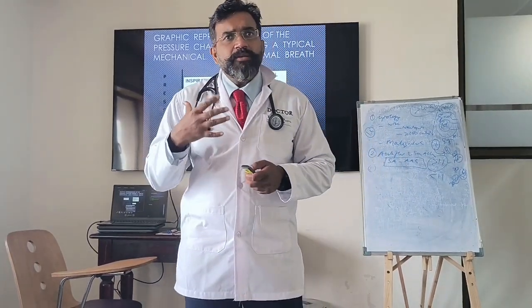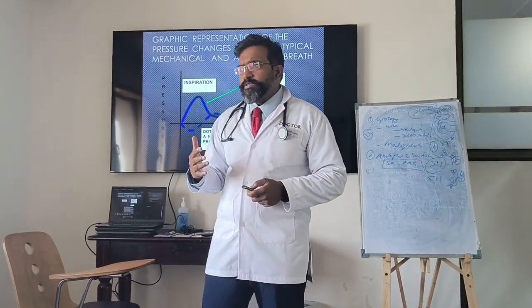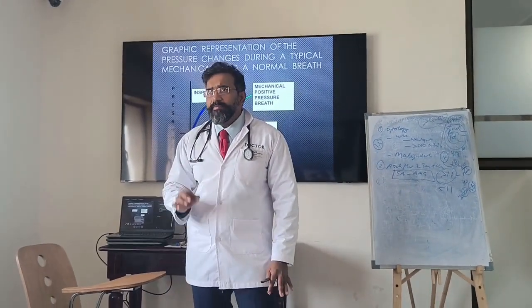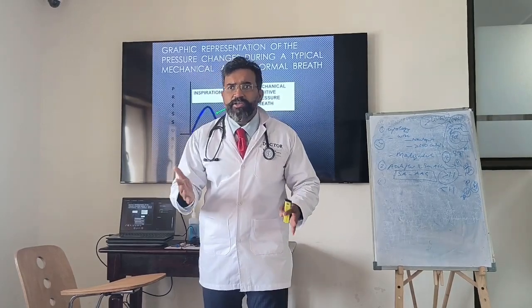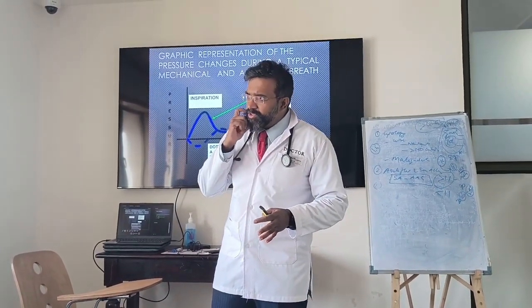So the ventilator per se is completely non-physiological. Our attempt is to make it as close to physiological as possible for our patient. Every time you stand with a ventilator, you should realize that there is something wrong occurring and I want to reduce the wrongness. That is the basic thing you are doing on the ventilator. You are trying to reduce the wrongness that is occurring. Okay, clear on this till now?